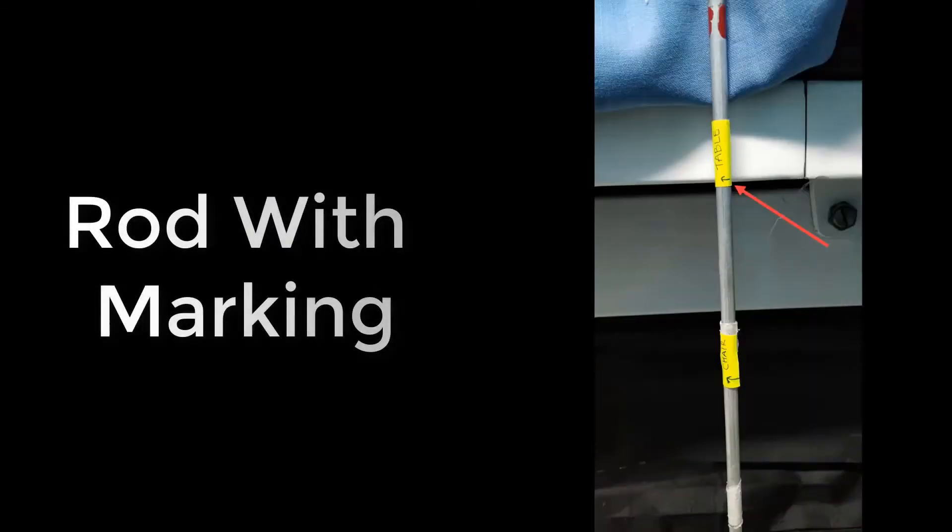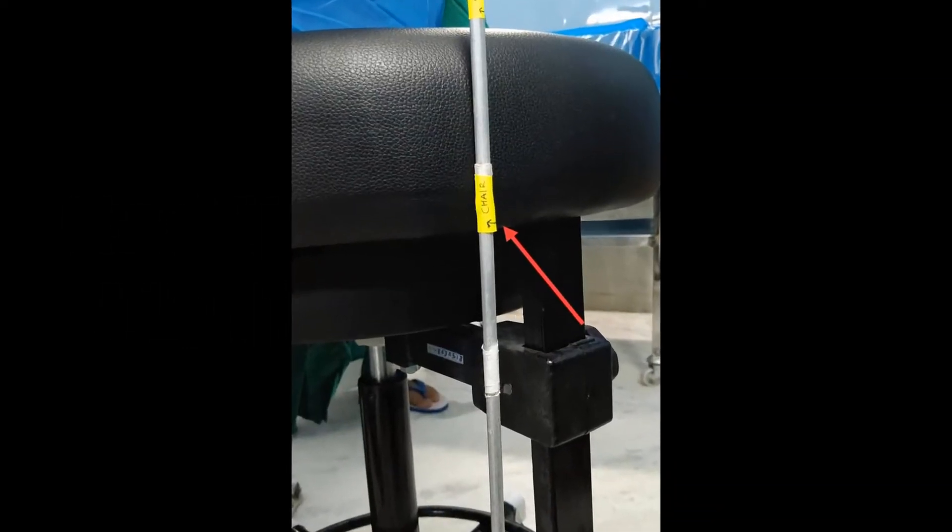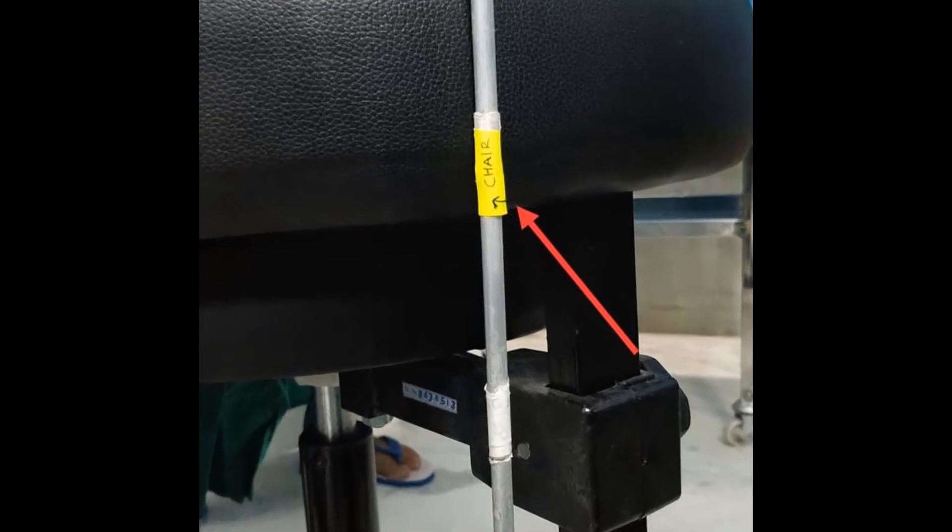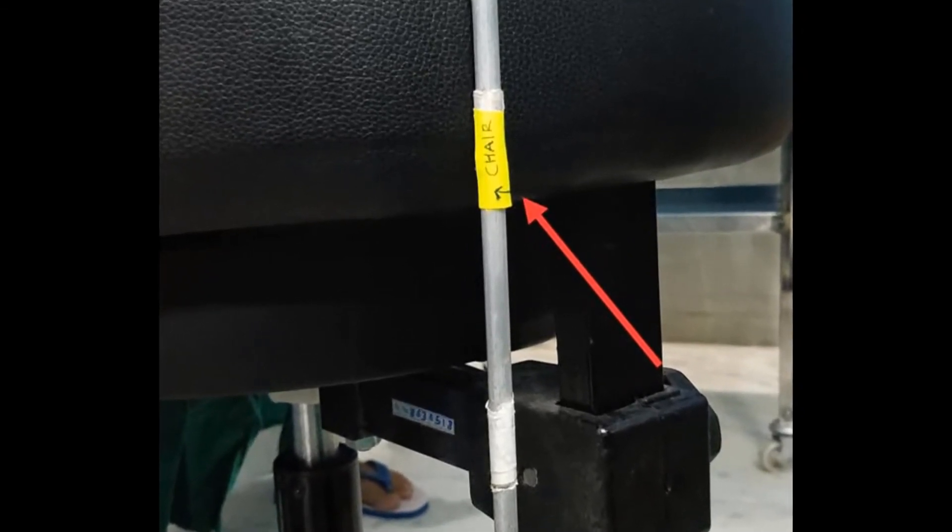A rod with marking can make your work easy. A metal rod with marking helps fix the table height and chair height for a specific surgeon with ease. This in turn helps in theatre flow and ergonomics.